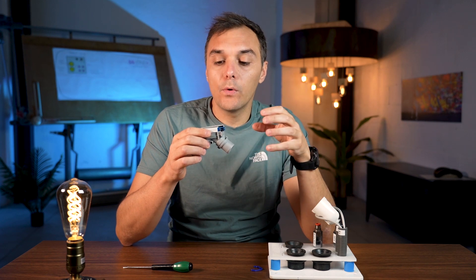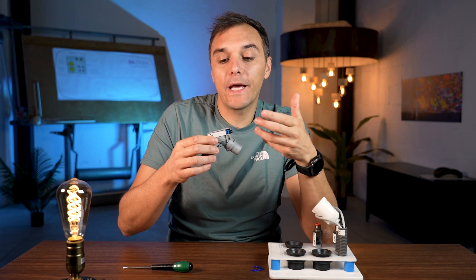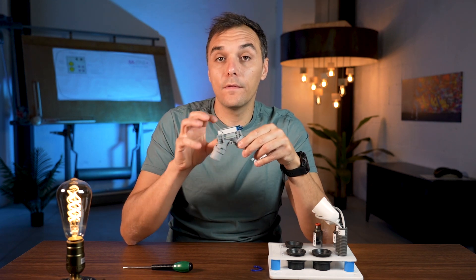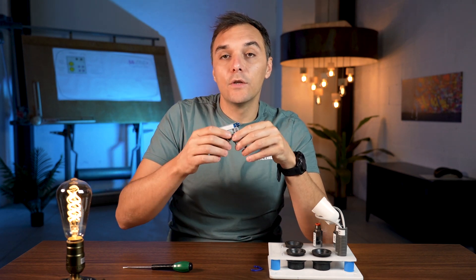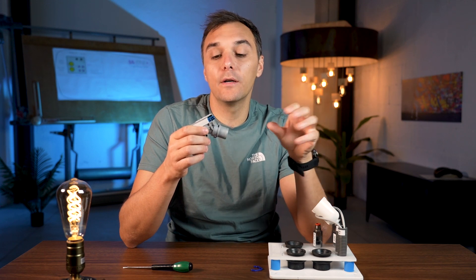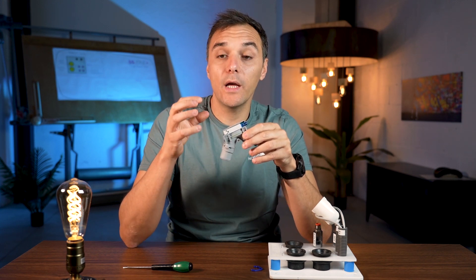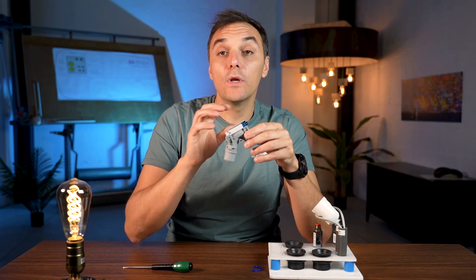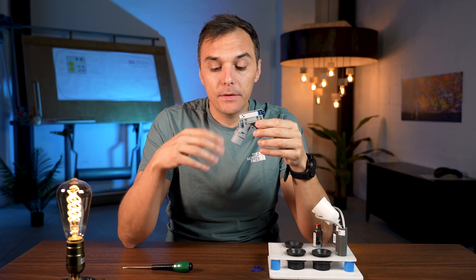To control the valve we normally use an electronic board that gives power to the valve when the cannula is opened — we cannot give 24 volts all the time. It's also important to control the closing delay, because if the valve closes immediately when the cannula is put back, the dirty water — including blood — can remain inside the dental chair tubing. We use a small board that keeps the valve open for 10 seconds after the cannula is replaced, so all fluid drains to the suction motor. This board can also be sold separately if needed.